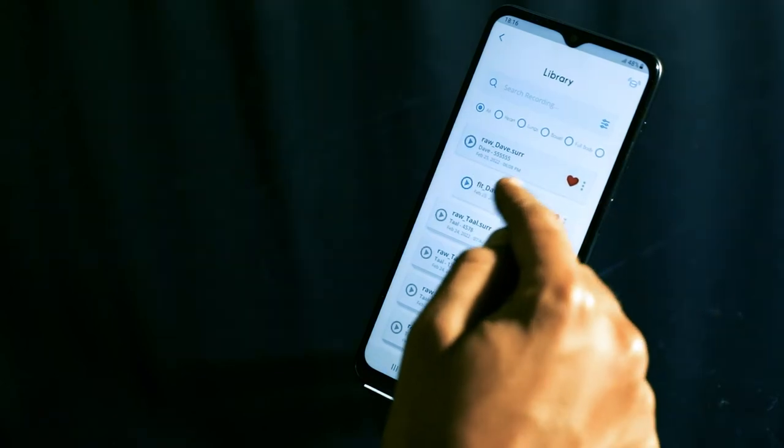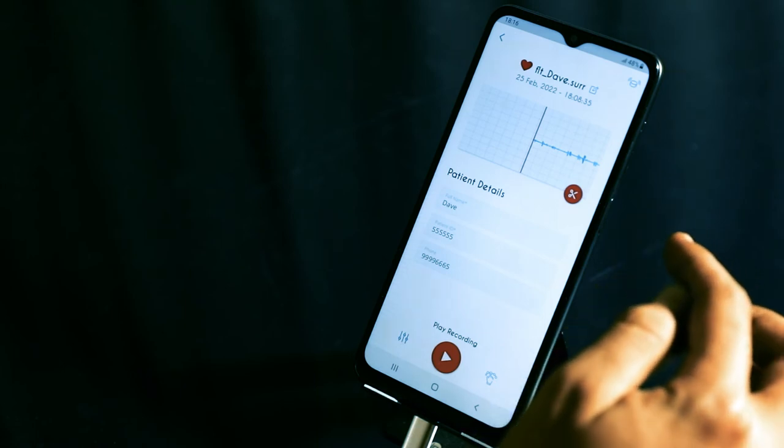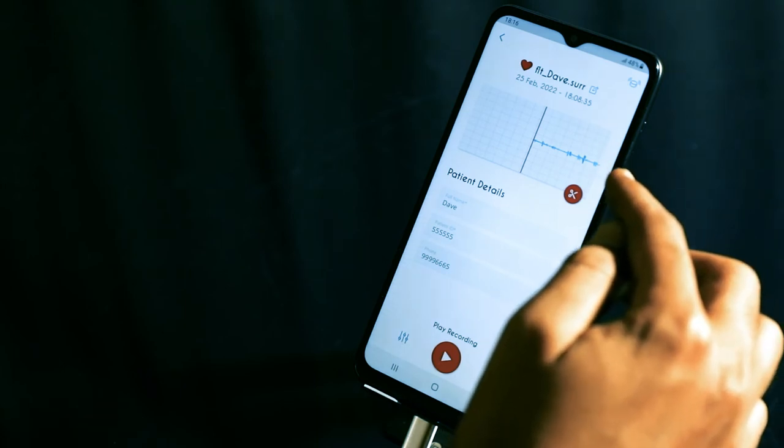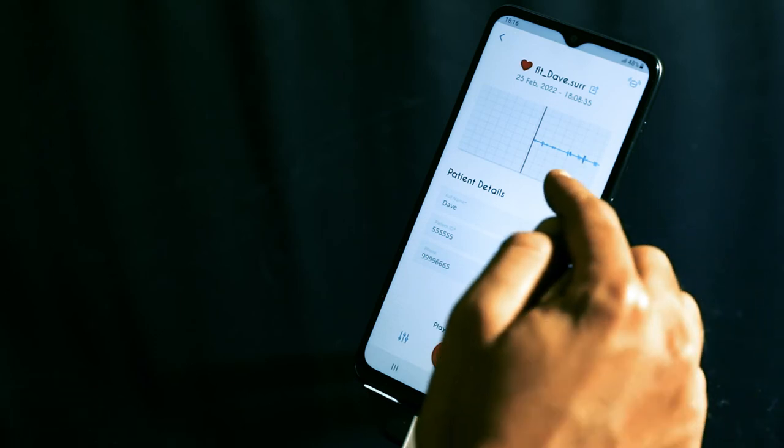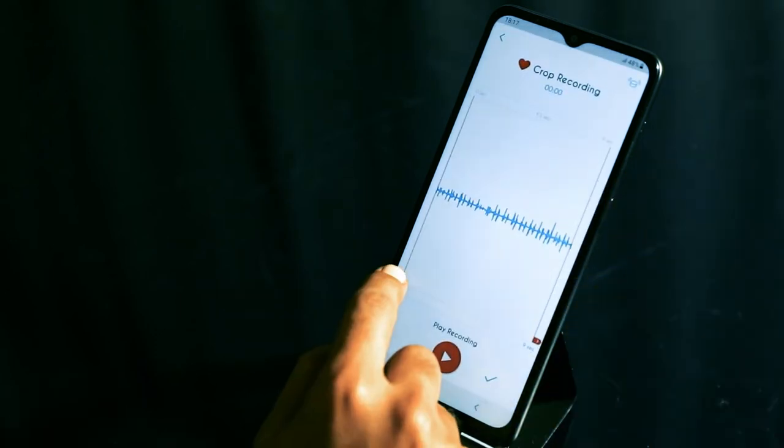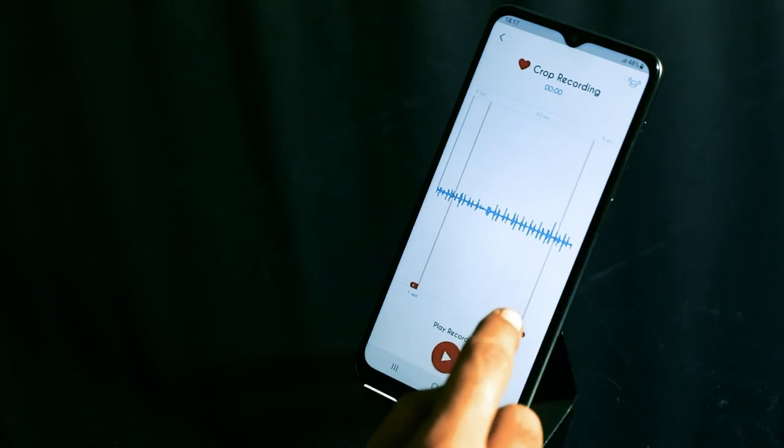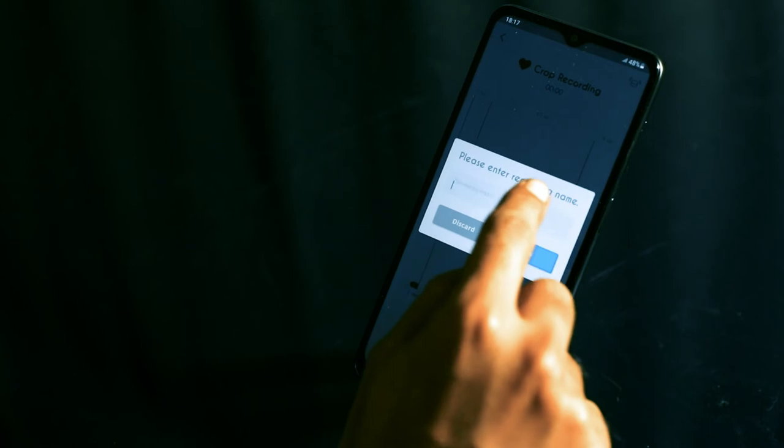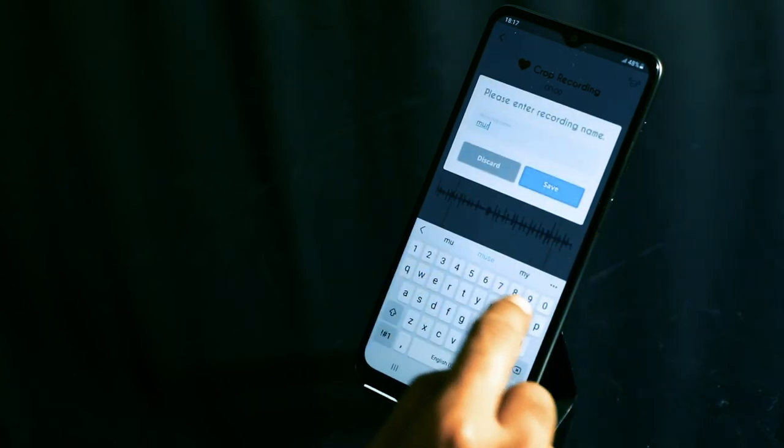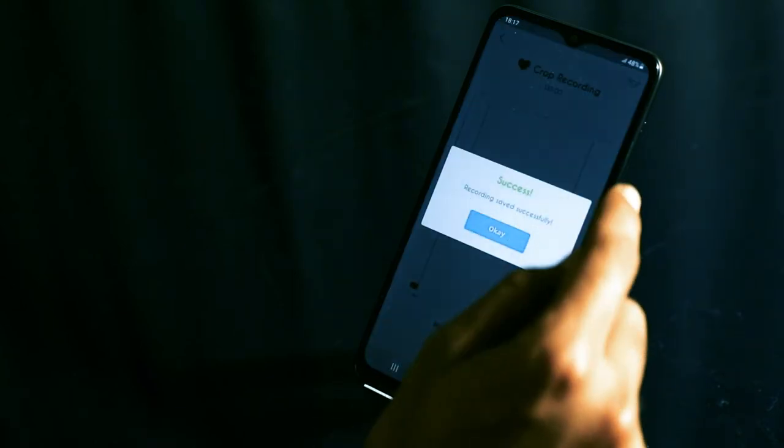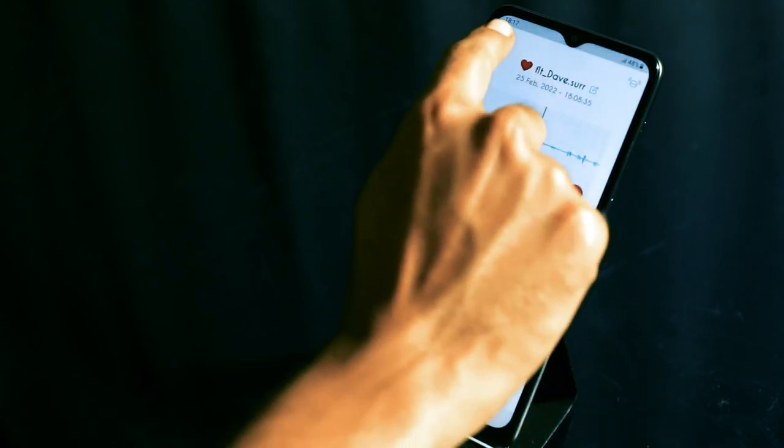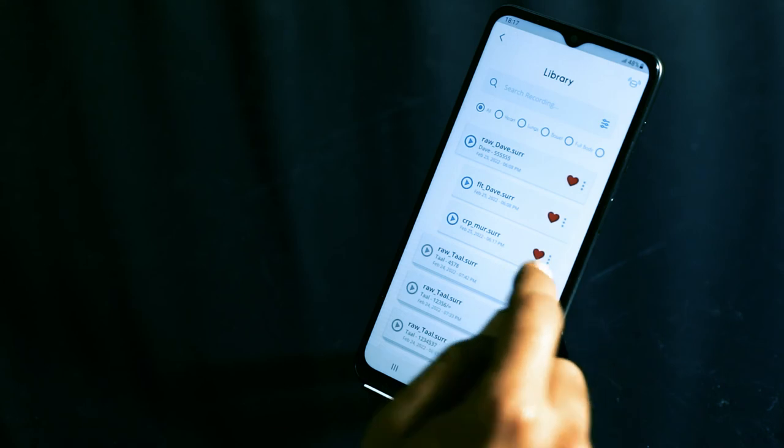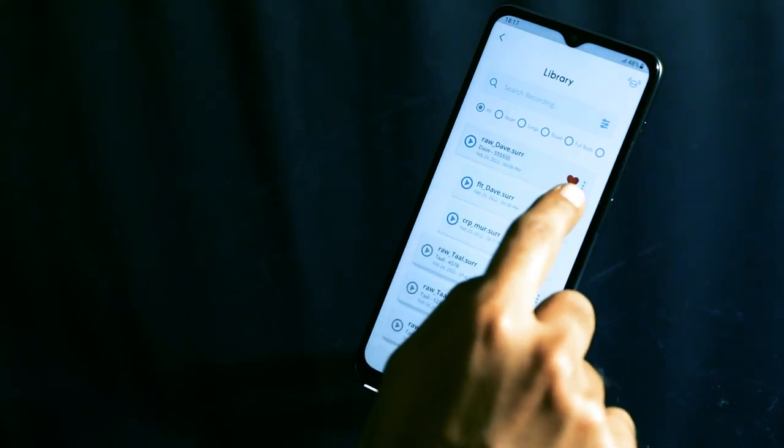This allows you to go in and edit the sound further in post processing. What you see here is the edit screen. The first function on the edit screen is cropping. Cropping allows you to select a portion of the sound that you want to focus on. You can then save this file as a separate name. This saved file now shows up in the library as a separate file under the main raw file.